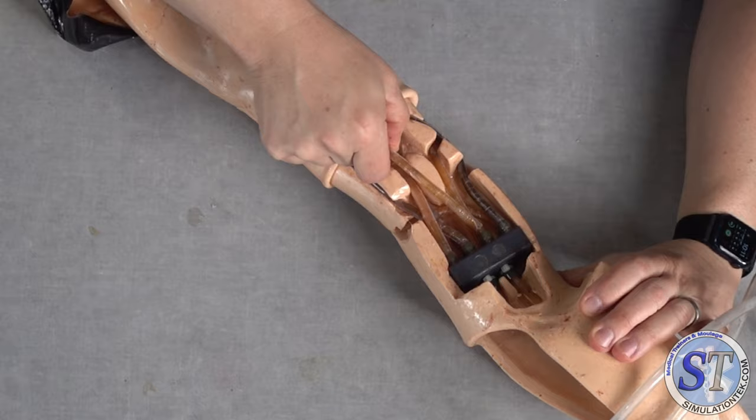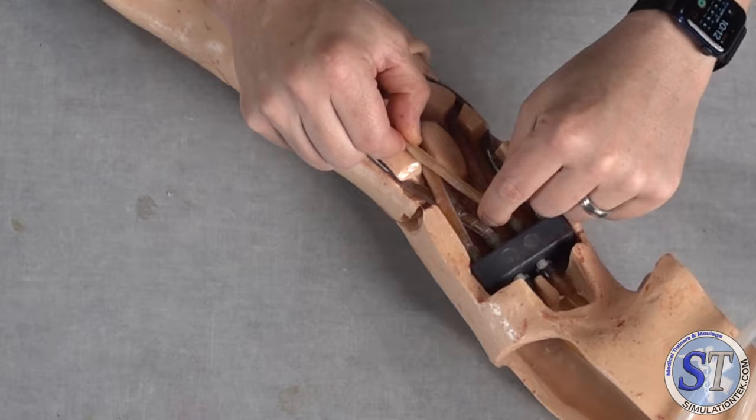If you look, most IV arms, the tubing when you get into it is going to be latex tubing. So if you have an allergy, you have to be careful and protect yourself. These actually have a coating on them to protect you, but if you peel back that coating and touch this, this is still latex. Well, why latex? It's 2023 now, and we should be using silicone and non-latex, and I'm a huge proponent of that. I don't like using latex where we can help it. The "where we can help it" is the key.